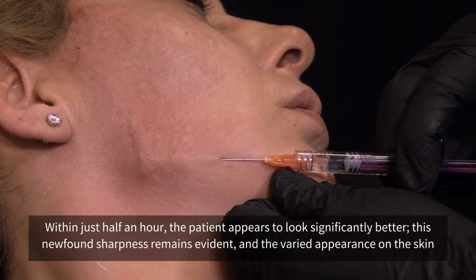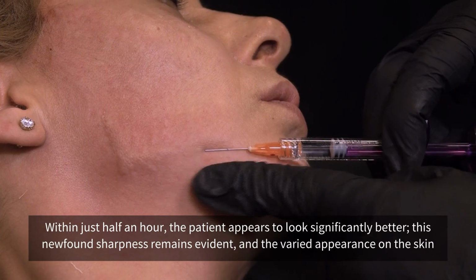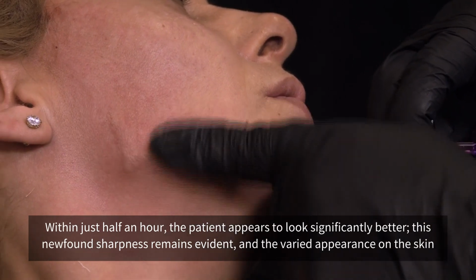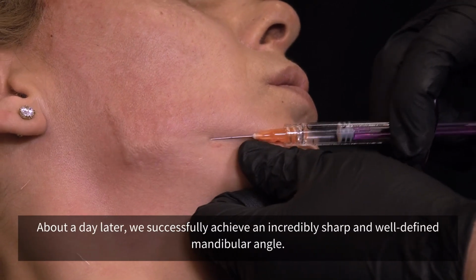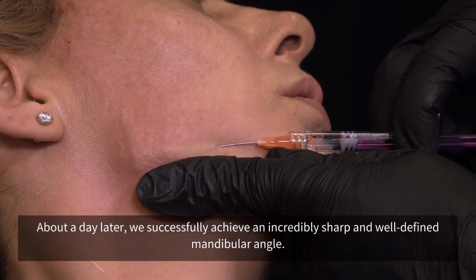Within just half an hour, the patient appears to look significantly better. This newfound sharpness remains evident, and the varied appearance on the skin surface gradually disappears. About a day later, we successfully achieve an incredibly sharp and well-defined mandibular angle.